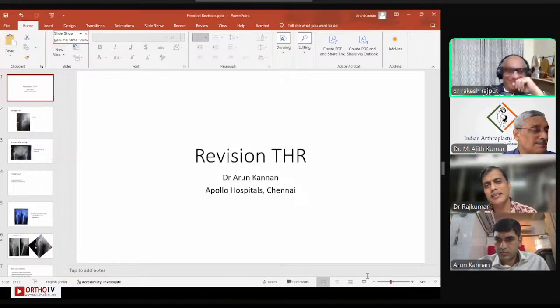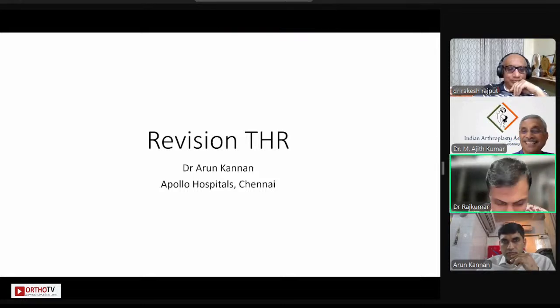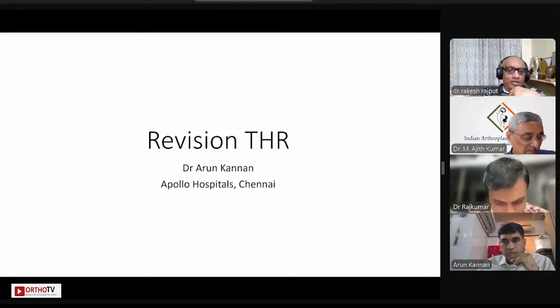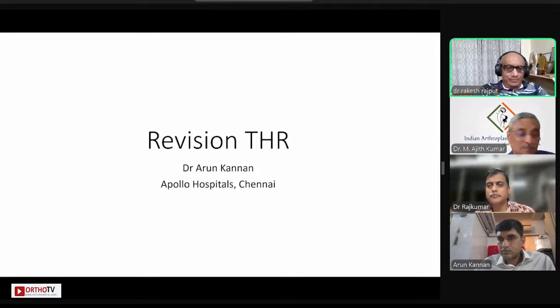Well, see, that's the funny thing. A company knows they have problems, and they also bring out the solution. Those solutions, to remove the broken solution stem, they have those trephines. So to remove a solution, they have another solution. It was like, oh my God. Ramnik, we shouldn't call it solution anymore. We should call it problem. Yes, it is a problem stem. It should be banned actually, straight away. Yes, Arun.